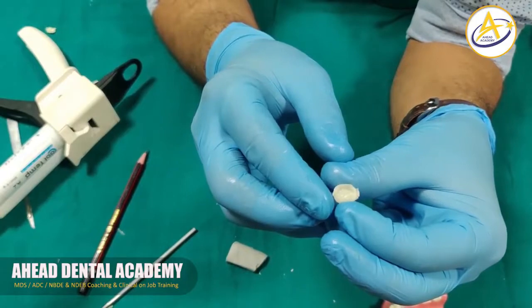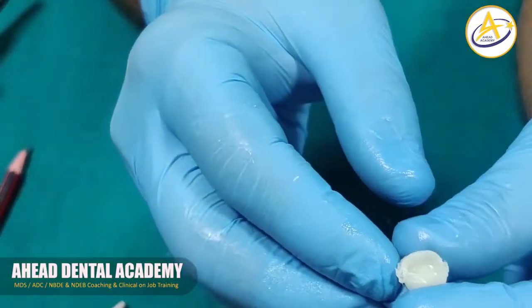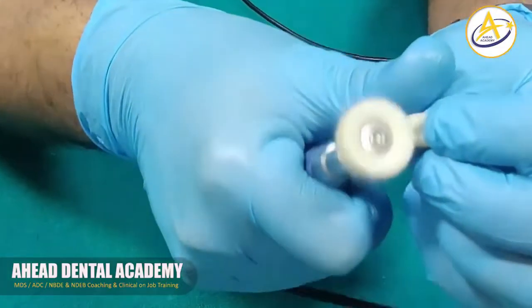And we'll shape this according to the margins, and then we'll seat it and check the seating.